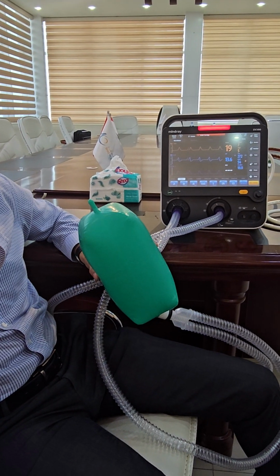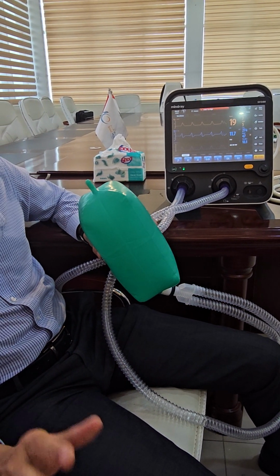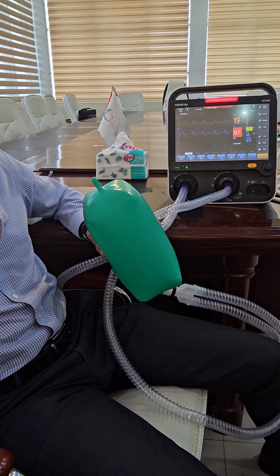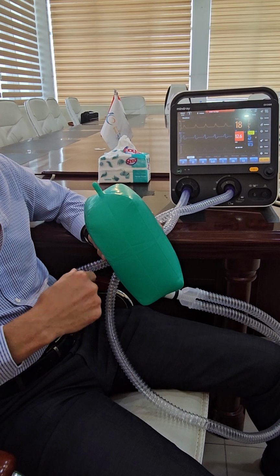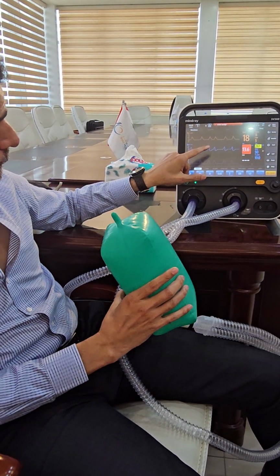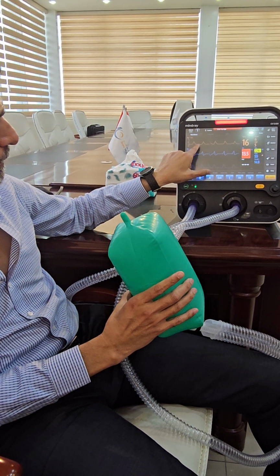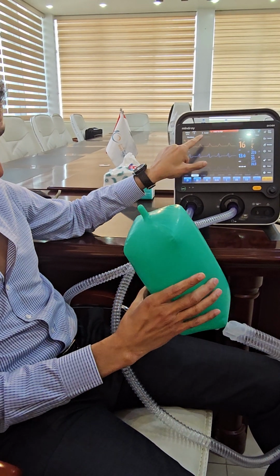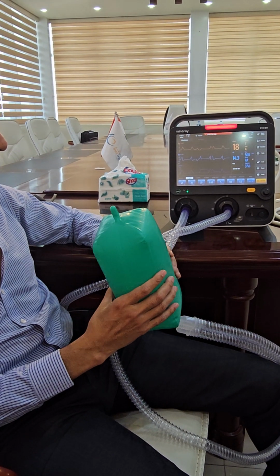Is that clear? So two points. First, you will never see spontaneous. Second, it gives the control, the mandatory breaths delivered by the machine, and it helps the patient when they breathe. It will never breathe alone. Look how regular it is now. Once I do something, it gives me a breath. Now it's not giving me one, because this effort is very small. But when I make a good effort, it will give.